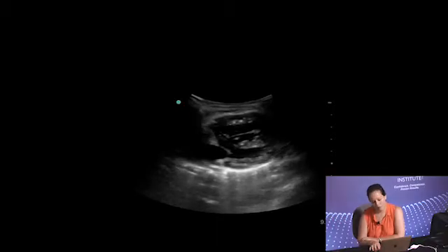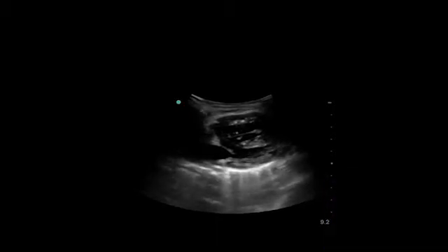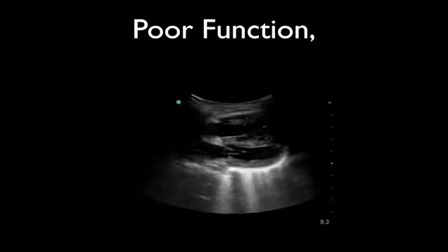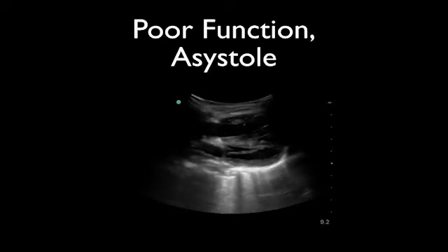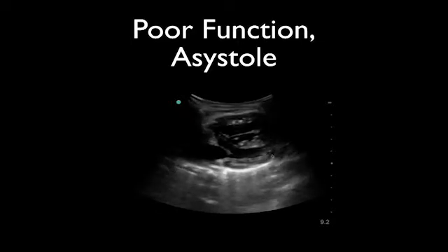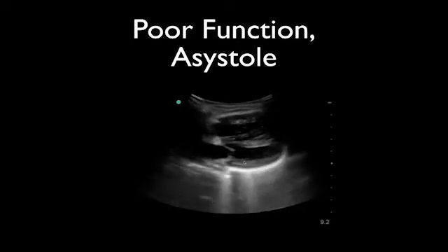Now what about this one? Any age, doesn't matter what age. Yeah, pretty much, that's yuck. So that's not only poor function, but that's actually asystole. If you have a little bit of valvular movement, that doesn't really count. So you see the wall, it's not moving. You can almost barely even see what kind of view this is because it's just such bad function.